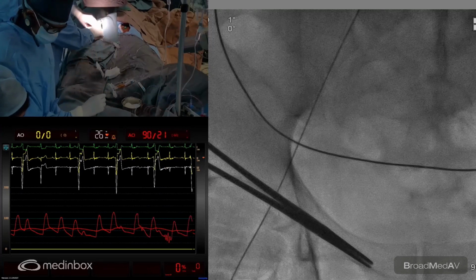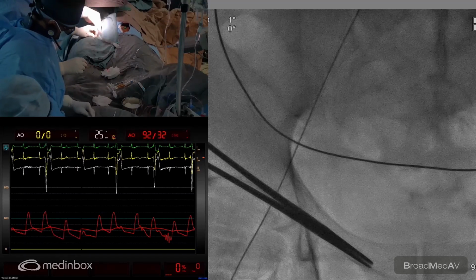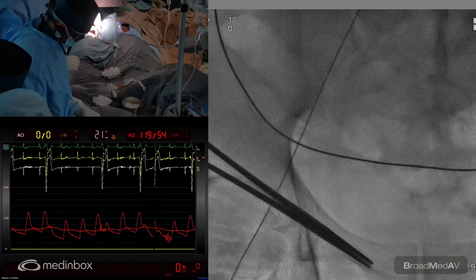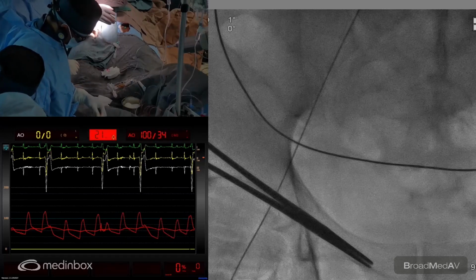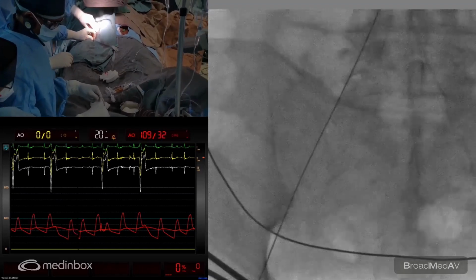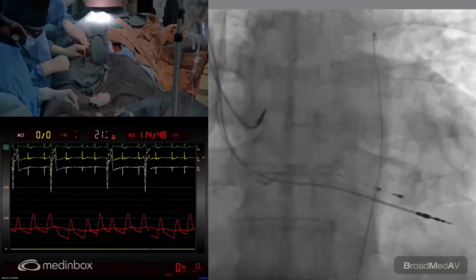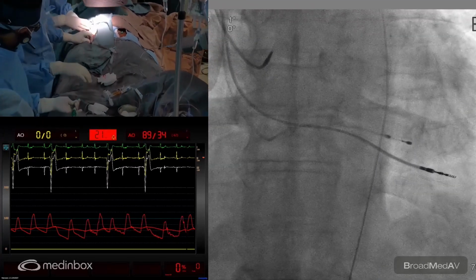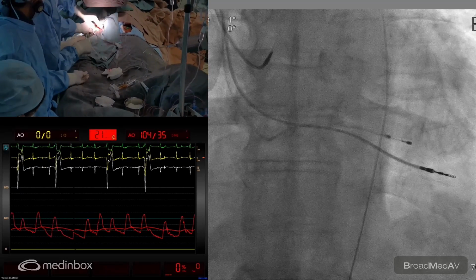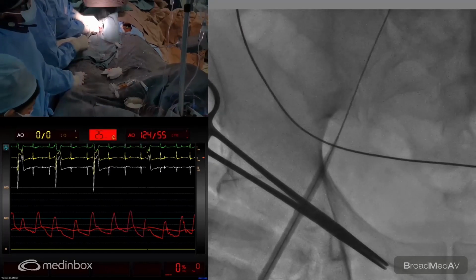Okay, so Ashish is on the groin. He's holding the groin, and Dr. Nandakumar will now help me with the sheath. As you can see, the sheath has a port on the side. It's 14 French, and we can go up to 18 French if we want. Up to 20, I think 23 millimeters, we have no problem.